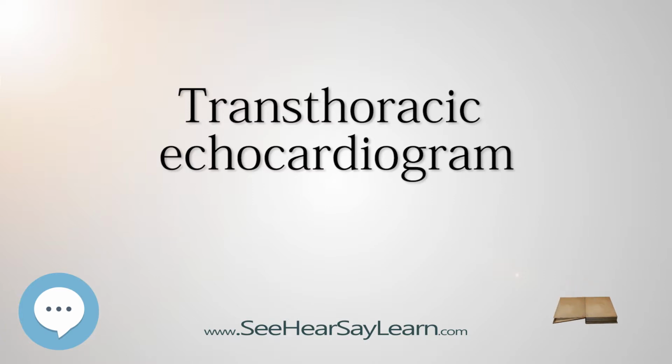Transesophageal echocardiography may be more accurate than TTE because it excludes the variables previously mentioned and allows closer visualization of common sites for vegetations and other abnormalities. Transesophageal echocardiography also affords better visualization of prosthetic heart valves and clots within the four chambers of the heart. This type of echocardiogram may be a better option for patients with thick chests, abnormal chest walls, chronic obstructive pulmonary disease and the obese.